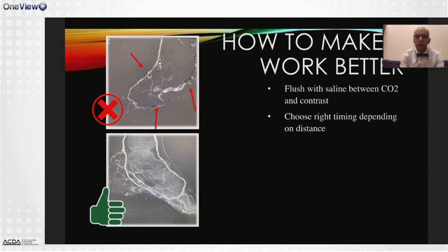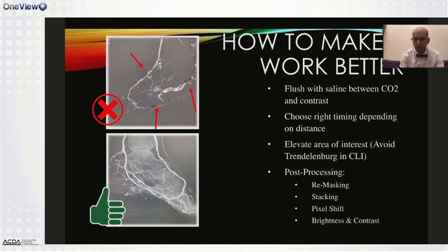Elevating the area of interest, we talked about that before, for example, for the aorta, but be very careful in patients that have CLI, because that might increase the ischemia a little bit and make things a little bit worse. Post-processing, I can't stress this enough.